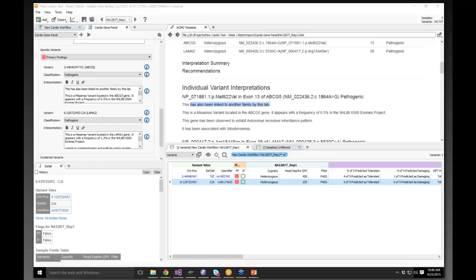You're going to have to worry more about, given the quality of DNA and the sequencing depth, what can I expect for sensitivity and specificity. So a lot of this is still relevant if you're on the frontier of research genetics and you are calling whole genome variants, or large structural variants, or more complex variants in these scarier regions of the genome that don't have a lot of unique sequence. But for the purposes of NGS gene panel testing, a lot of that's just pretty much handled for you.